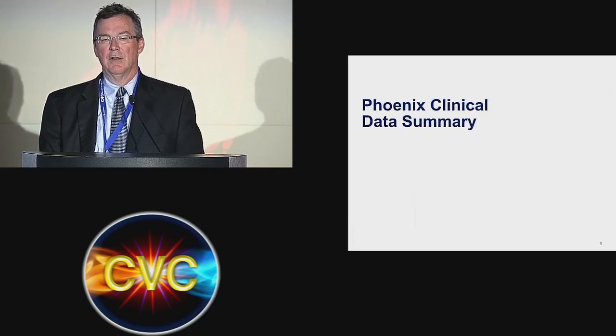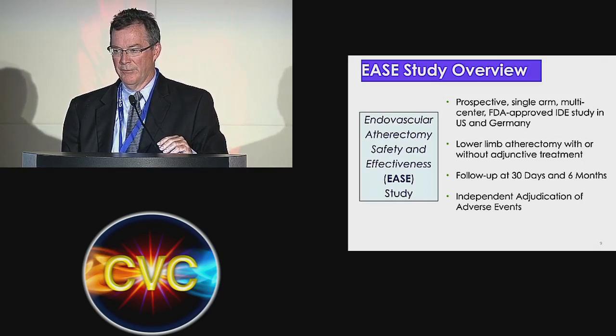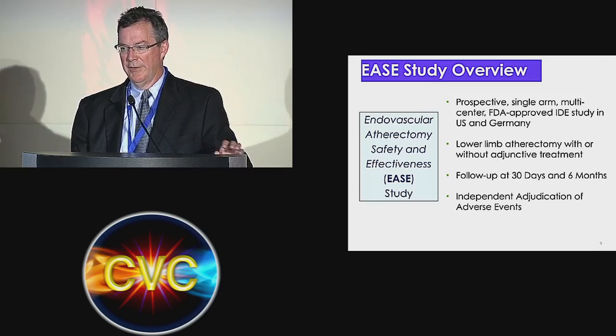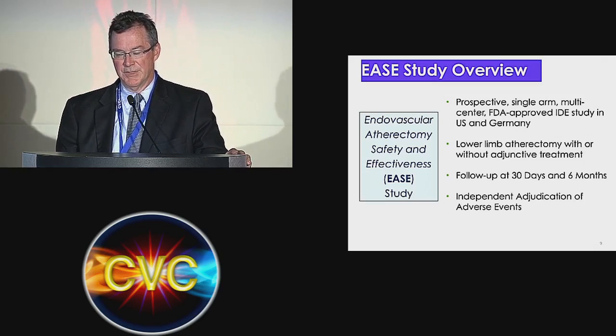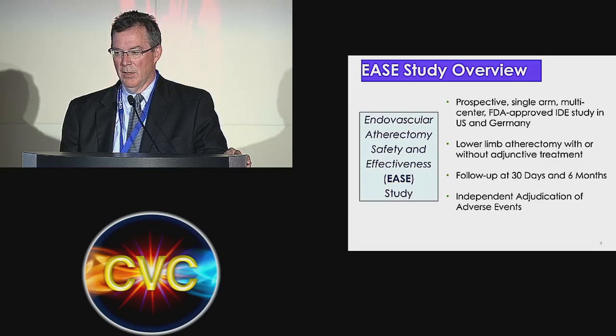So the clinical data from the Phoenix trial, this was the EASE study. Dr. McKenzie and I were the PIs. It was an IDE. It was mainly a safety trial to get approval for the device.